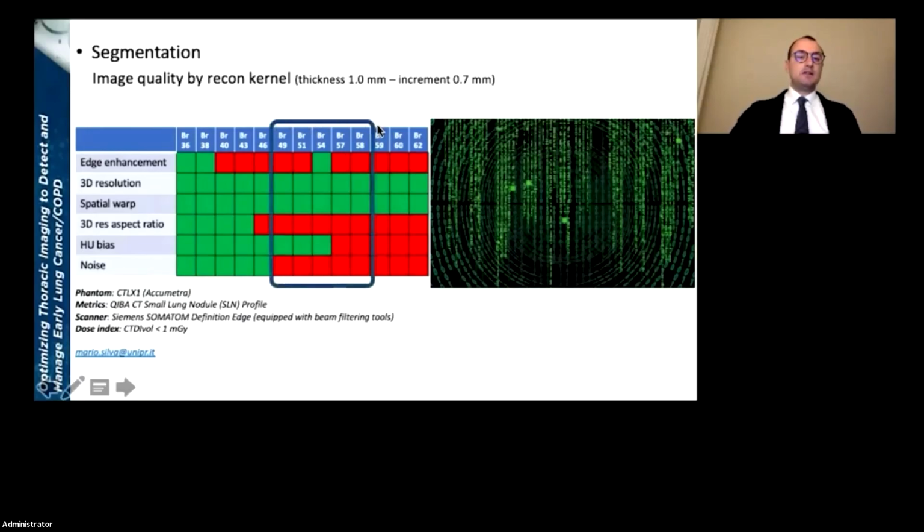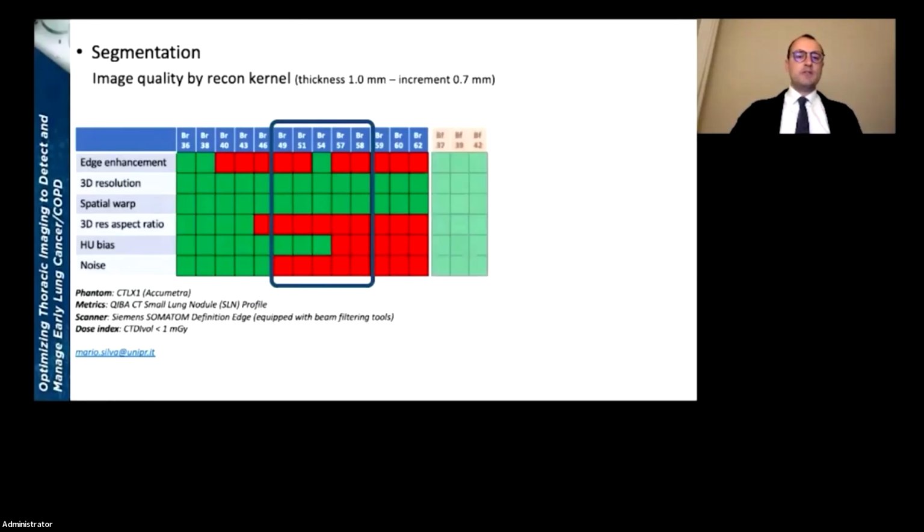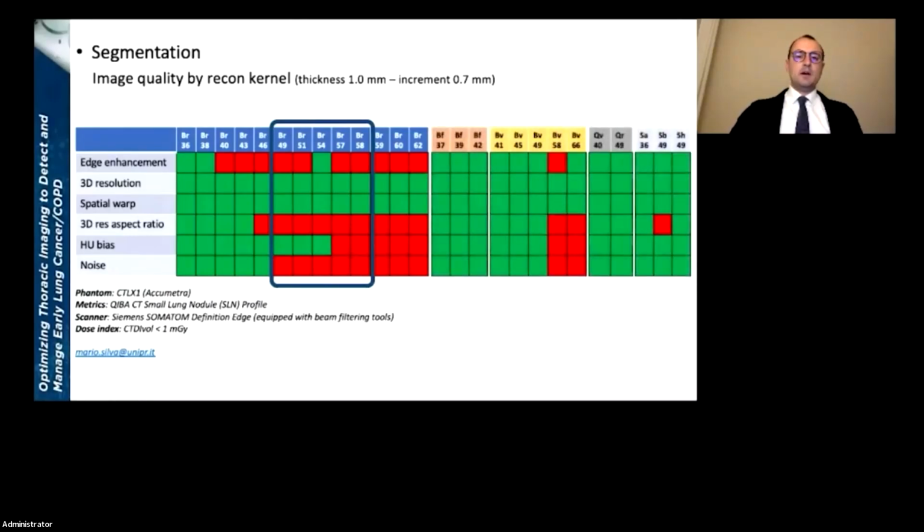This is mainly the main box of kernels that you might be using for reconstructing low dose for visual reading. What about algorithms to read these images? Well, you have a bunch of further kernels that might help you.